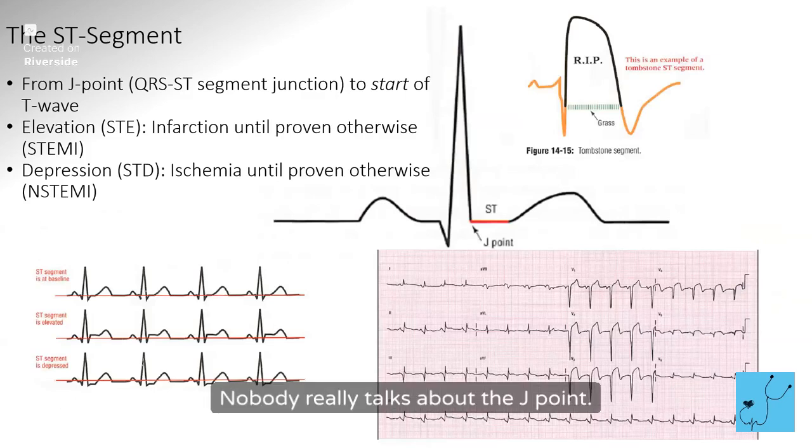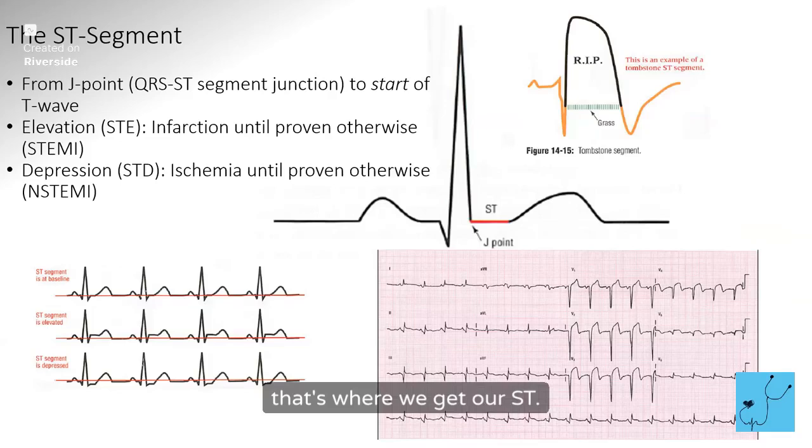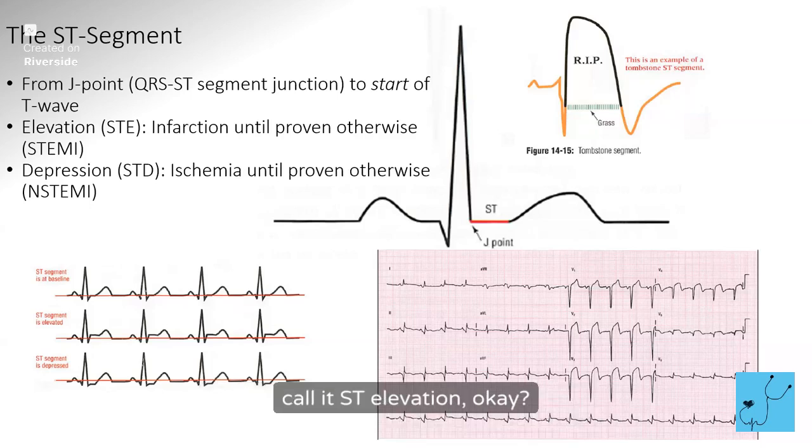Nobody really talks about the J point. It's just a way to talk about the rhythm. Where the QRS comes back to the isoelectric line is where the ST, where it leaves again, that's where we get our ST. So if this QRS doesn't come back to the isoelectric line before the T wave, then we call it ST elevation. Okay.